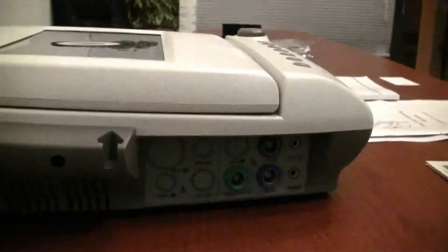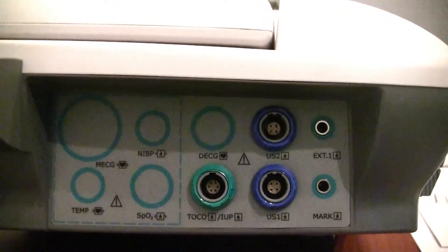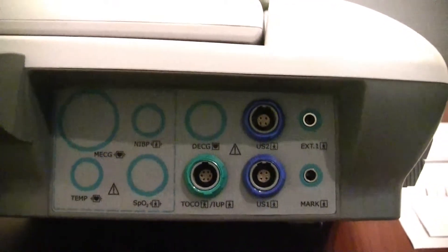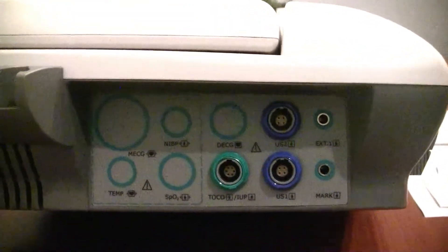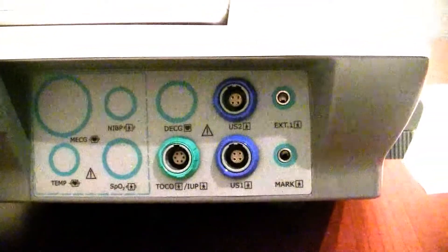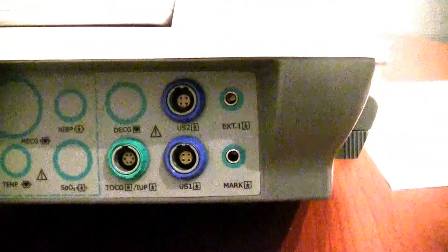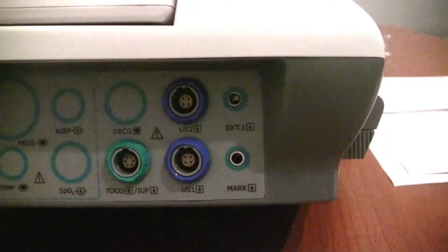Looking at the other side, the DECG and IUP is an available option, though this particular unit does not have it. You can also see the ports where, if this were an F6 Express, we'd have additional parameters as well. These are your connection ports for your TOCO and your fetal heart rate probe, and your event marker.